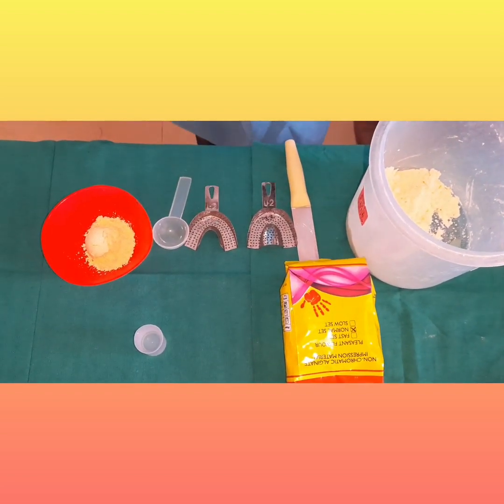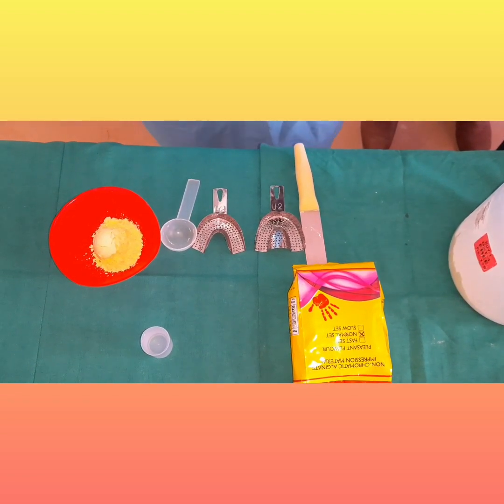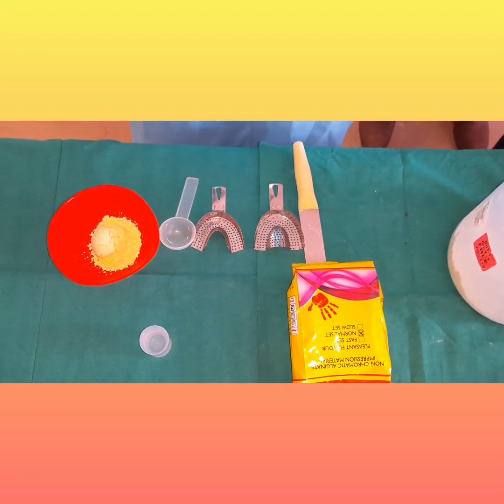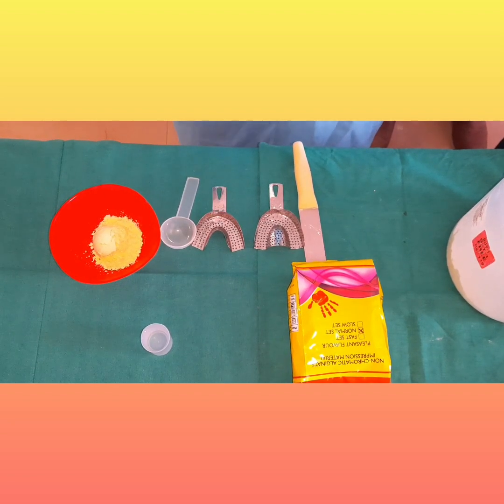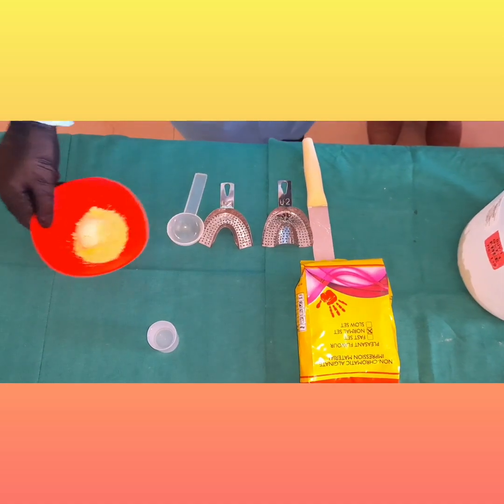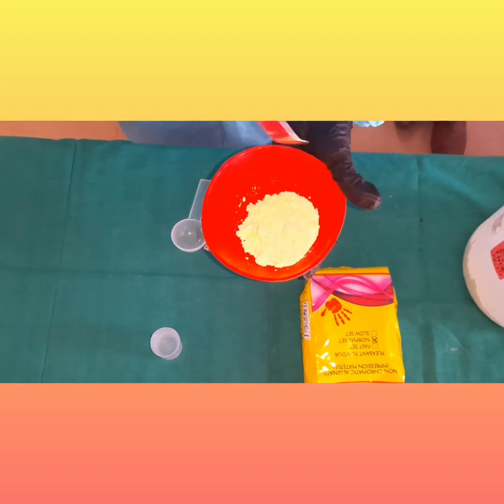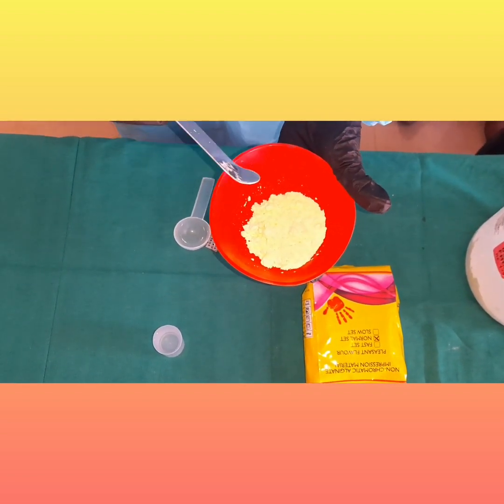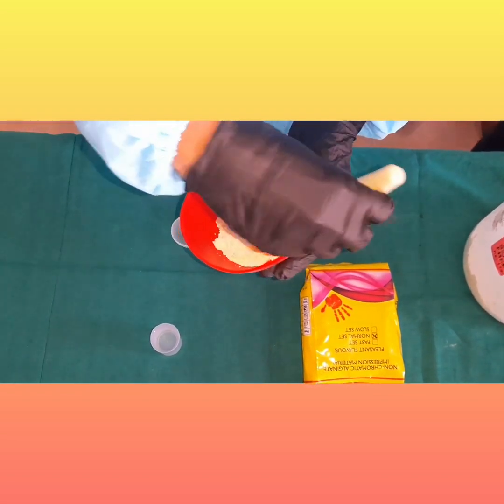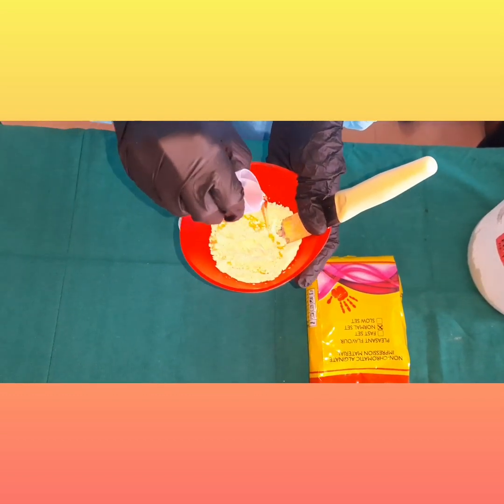The water-to-powder ratio for alginate impression material is 2:1 — that is two parts of water and one part of powder. One part of powder is around nine grams. We will be taking water and alginate. You should take water first and then sift the alginate in. Since I have taken the powder first, I have to be very careful when mixing the water.